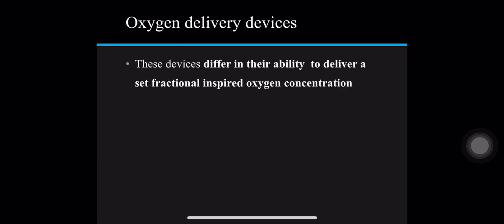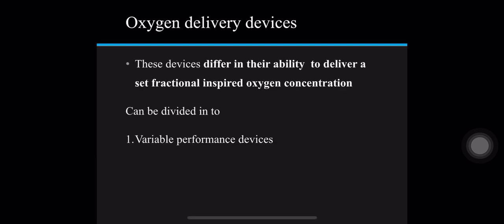Frankly, oxygen delivery devices can be classified into variable performance devices and fixed performance devices, depending on their ability to deliver a set FiO2. FiO2 means fractional inspired oxygen concentration. The normal FiO2 in the air is 0.21.